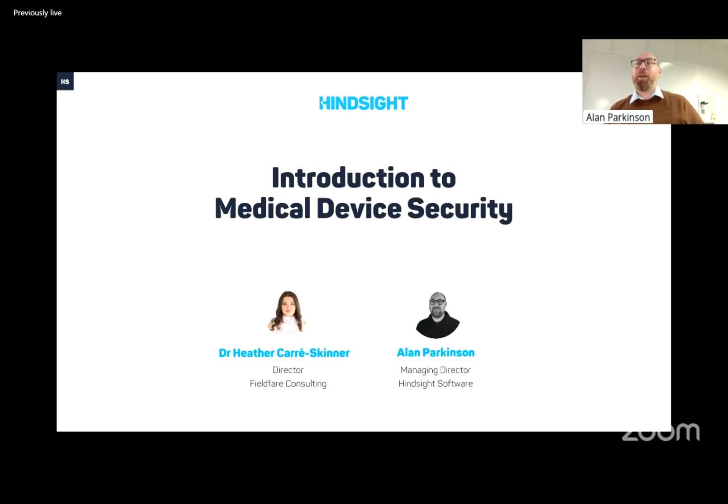Being able to intercept libraries and get an essentially tampered-with version of the library into a medical device would be a good attacking route. And the important thing to think about is that your medical device might not be the intended target. It could be just collateral damage. Somebody could be targeting a particular hospital, your device has the same vulnerability as other systems there, and your device goes down along with the rest of the hospital systems that were the original target. So it's a wide field. We're going to get a lot of new guidance over the years, but it's all risk-based. Absolutely.